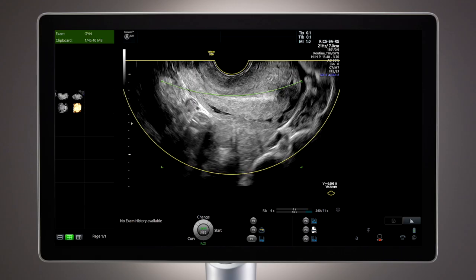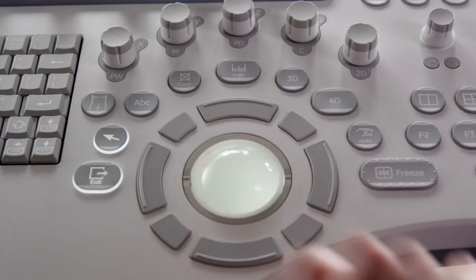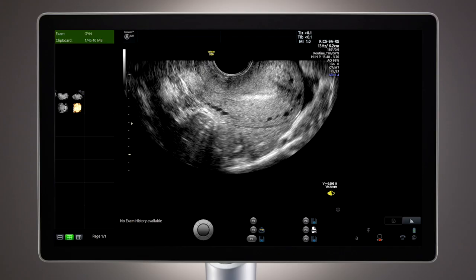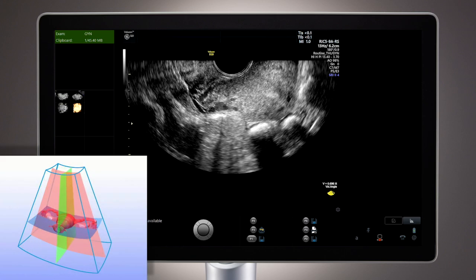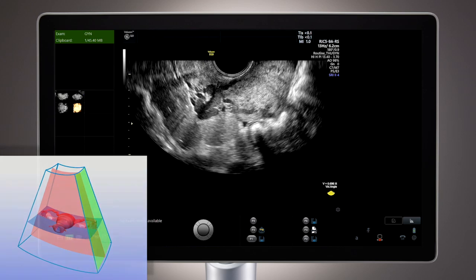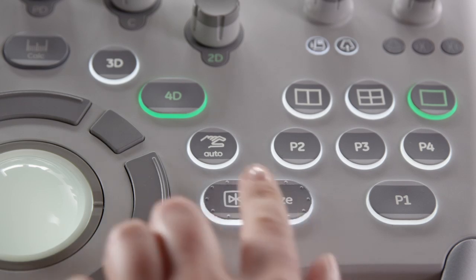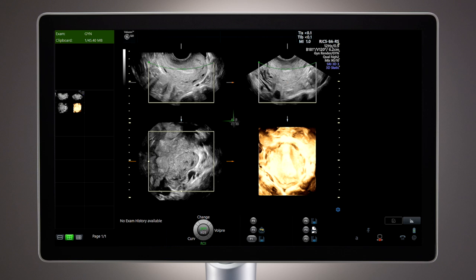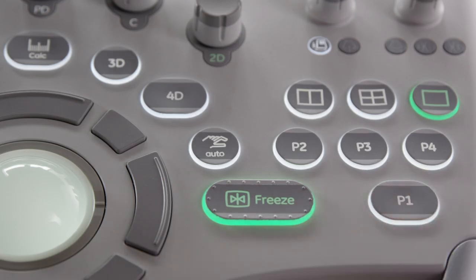Begin by scanning what will be the center of the volume. Select the Start Trackball key to begin acquisition. The elements in the probe will scan from one side of the uterus to the other, as seen in this graphic display. Once the acquisition is complete, the volume should be displayed in a multi-planar view. Selecting the Freeze key or VolPre Trackball key will cause the system to return to a live scanning state, so it's important to store the volume as soon as the acquisition is complete.